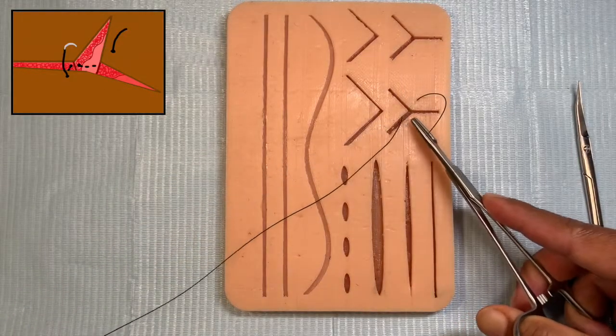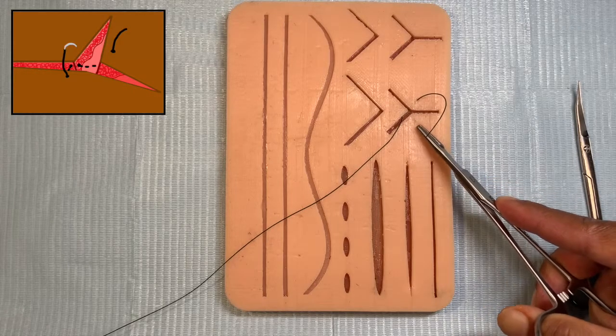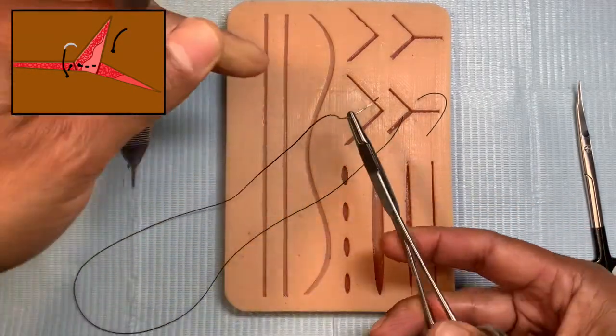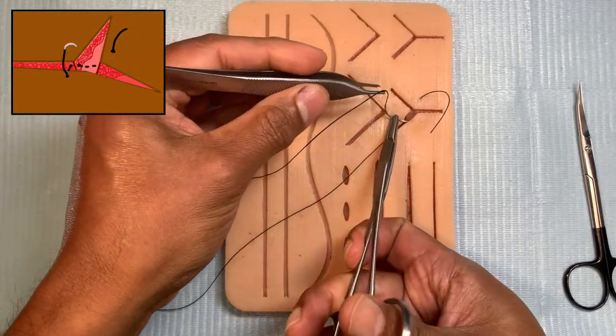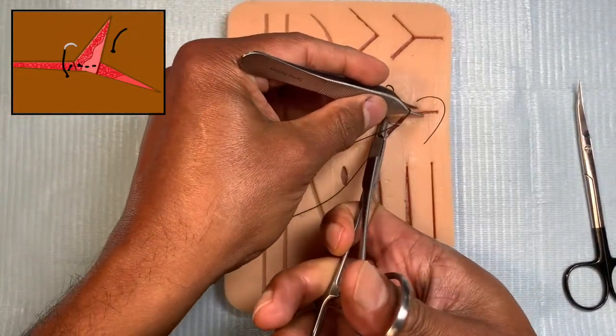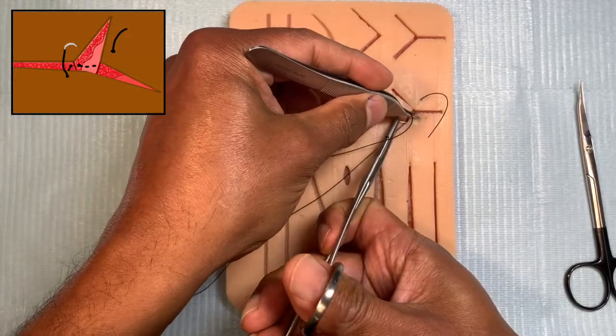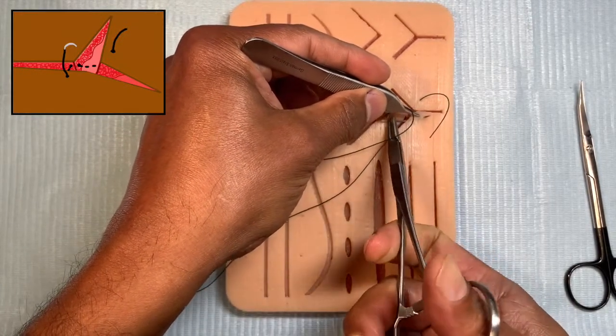Once you've done that, then you've got to bring it out here in a reverse triangle situation as we just discussed. So you reverse your needle and then you're going to bring it out this way, slightly further away from the wound. So you bring it through that.